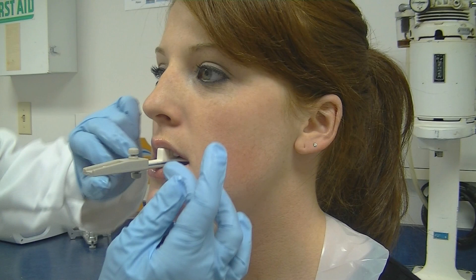Prior to placing your impression material on the fork, it is a good idea to recline your patient and have them sit for about 5 minutes with the fork at the location of where your start position is going to be for your oral appliance. At that point, when you come back in the room and the fork is in the patient's hand, you have an idea that that patient was fatigued and you can actually reset that to a more conservative bite position.